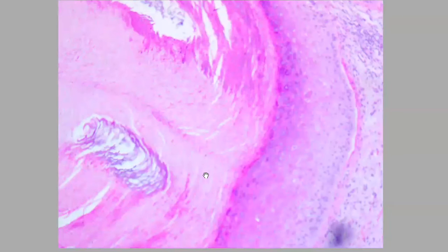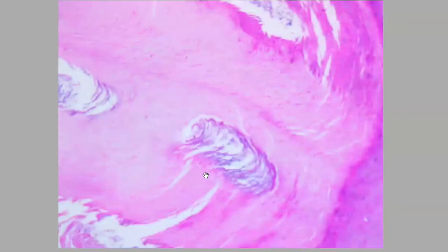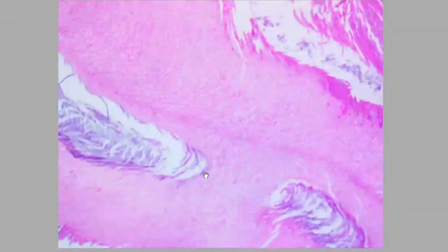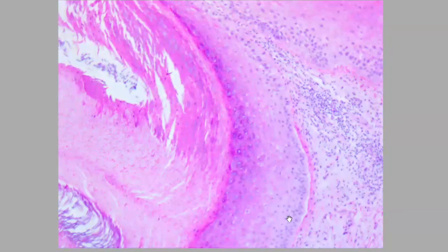In summary, the microscopic features from superficial to deep are hyperkeratosis with parakeratosis, and atypia at the basal layer, maybe more evident here in these atypical cells. Sometimes we have some inflammatory infiltrates in the dermis, and if we have a larger specimen, we can see some solar elastosis.